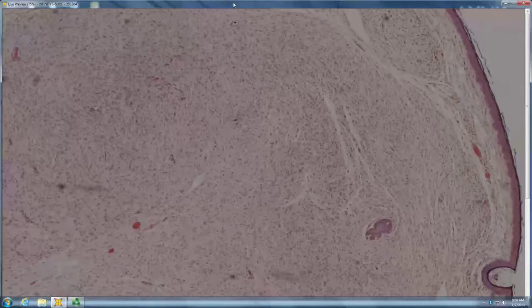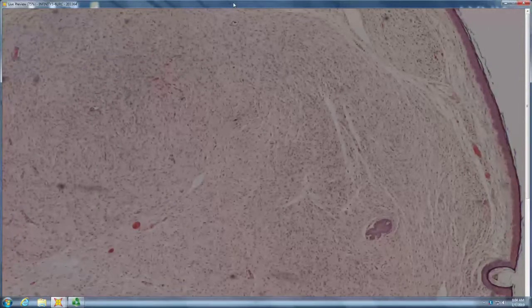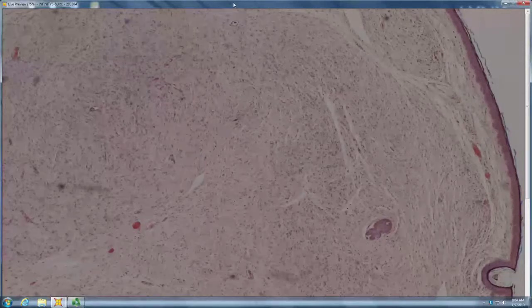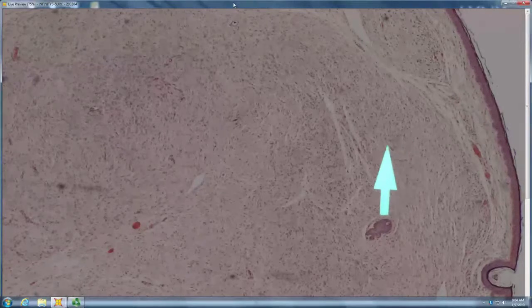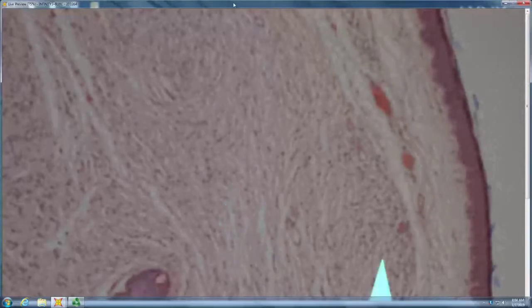So what do you see here? Very superficial nodule, non-encapsulated, very cellular with clefts inside of the tumor. And so is it clefts between well-formed fascicles, or is it closer to onion skin or plywood? Close to onion skin plywood.